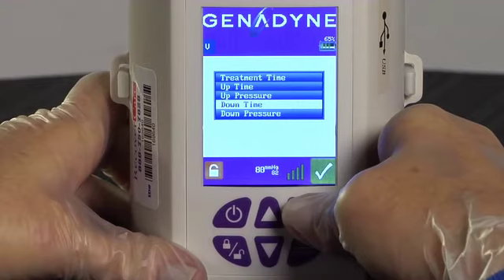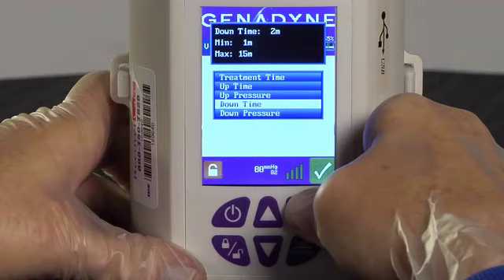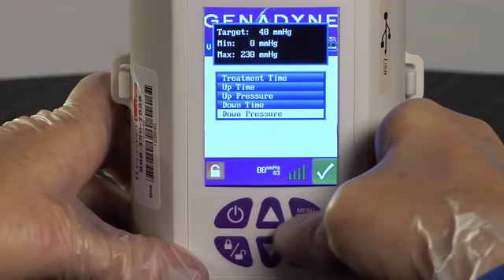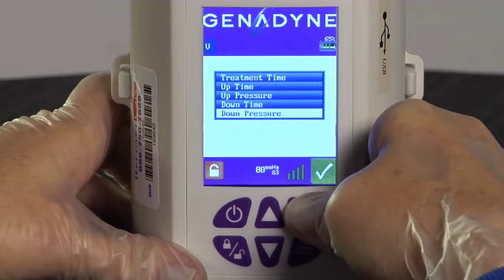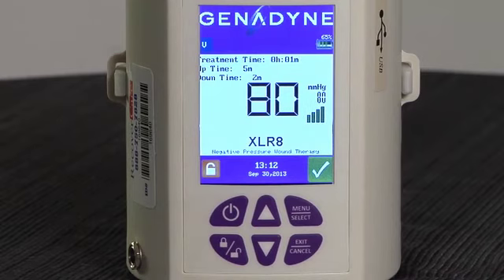To set the Down Time, use the Up or Down button to select Down Time on the menu. Press Menu Select again and, using the Up and Down buttons, set the Down Time at 2 minutes. This means the pump will draw at the lower pressure for 2 minutes before switching back to the higher pressure. To set the Down Pressure, scroll to the Down Pressure. Press Menu Select and use the Up or Down buttons to set the Down Pressure to negative 40 millimeters of mercury. Press the Menu Select button again to confirm the setting. To exit Programming Mode, push the Exit Cancel button 3 times or simply hold it for 5 seconds. The pump will display a checkmark in a green box in the lower right-hand corner of the home screen during the course of therapy if all systems are working properly.